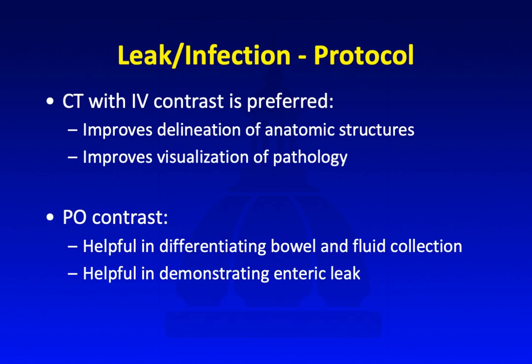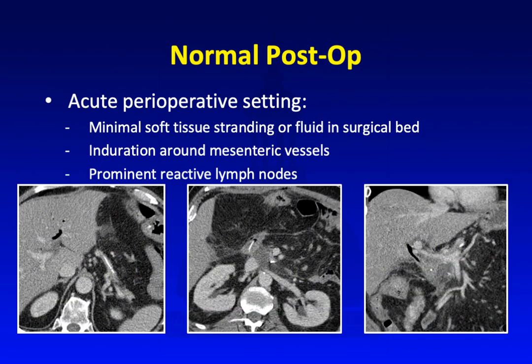In the leak or infection protocol, CT with IV contrast is preferred because it improves delineation of anatomic structures and visualization of pathology. PO contrast helps differentiate bowel versus fluid collection and demonstrates an enteric leak. In the normal post-op setting a few days after surgery, it's expected to see a minimal amount of soft tissue stranding and fluid in the surgical bed — such as this example after a Whipple resection — along with a little induration around the mesenteric vessels and a few prominent reactive lymph nodes.